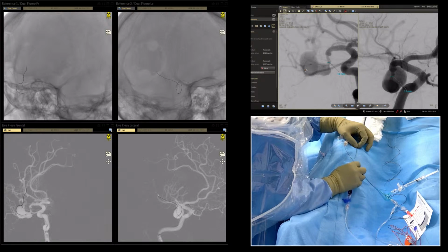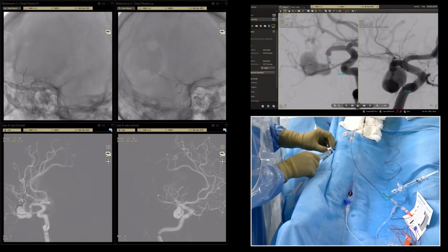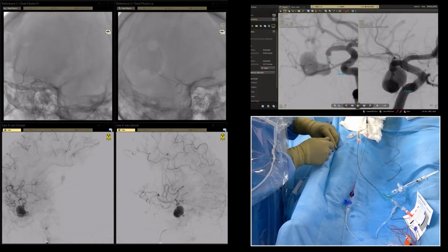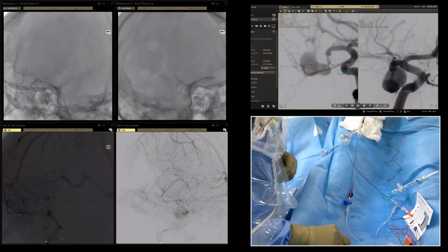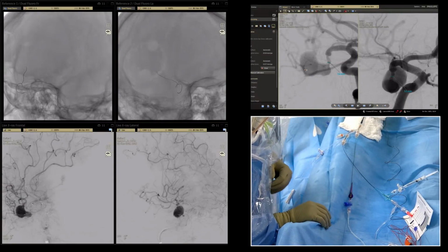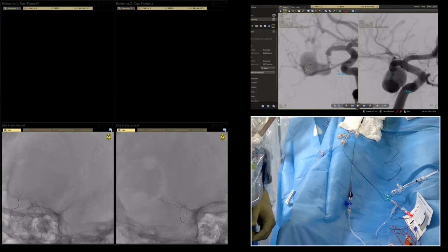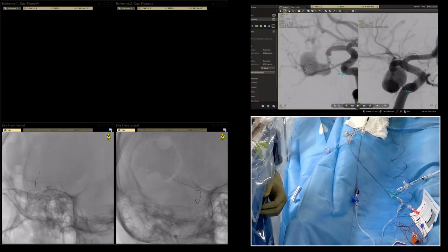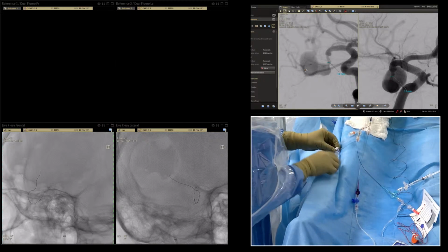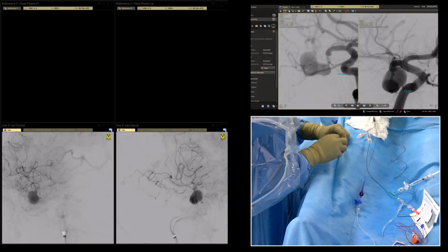It's a 15, no? Okay. Just a second. It looks like there is some kind of ischemia. Just a second. Yes, I agree with Maksat. We need to magnify the view. Okay.